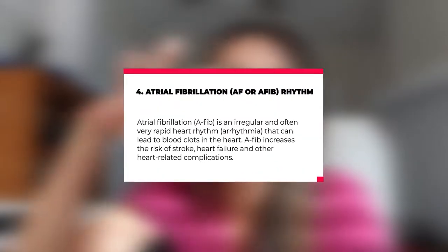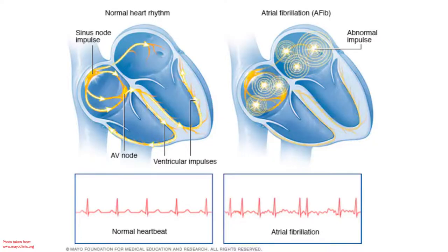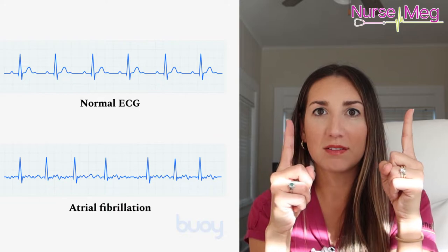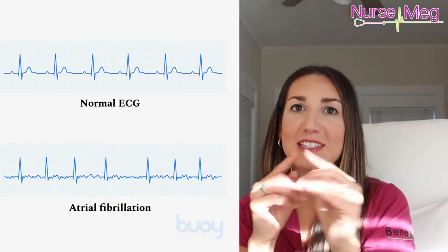Now let's talk about AFib, atrial fibrillation. Oh my gosh, what does that mean? That sounds so complicated. It's not. Atrial, which is the top little chambers of the heart that fill up, means that it's going bonkers. So this means that you have multiple little P's, little blips before the QRS. So it's not P, QRS, P, QRS. It's like P, P, P, QRS, P, P, P, P, P, P, P. And the distances between the R's are all wonky. They're not perfect, perfect. It's like, this one's here, this one's close together, this one's here. It's all off, okay? So that's another way to identify atrial fibrillation.